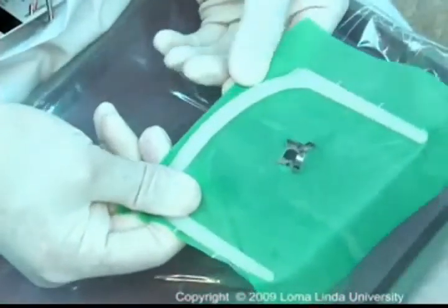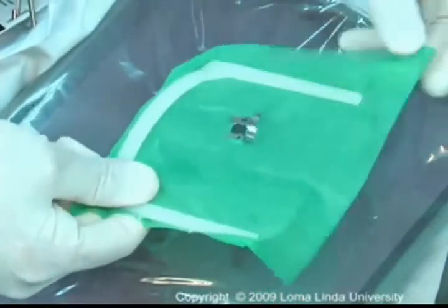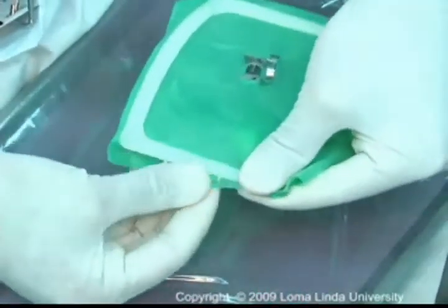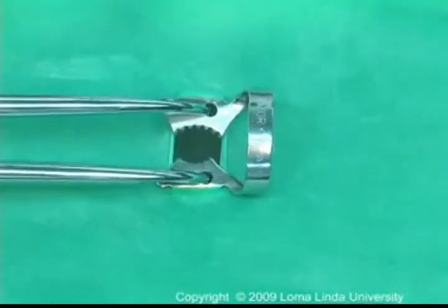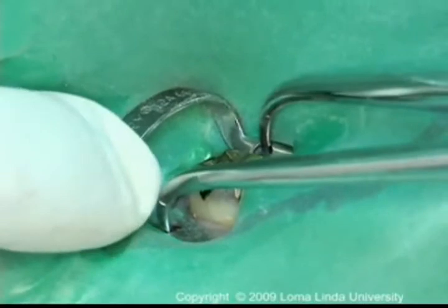The dam is placed on the frame so it is stretched tightly across the top and bottom but is slack horizontally in the middle. The dam, frame, and the clamps are placed as a unit to engage the tooth near the gingival margin.